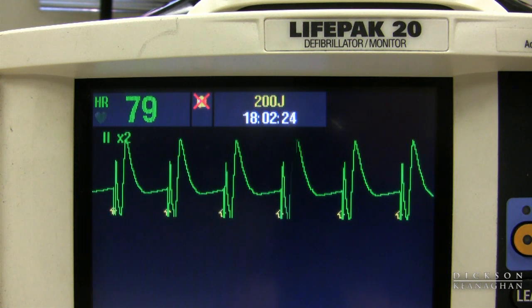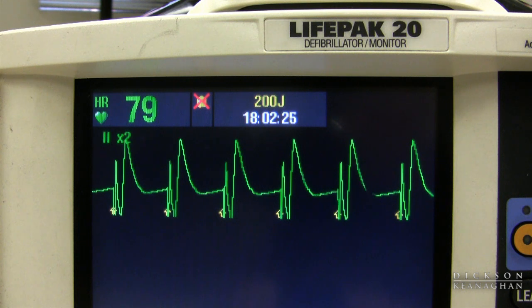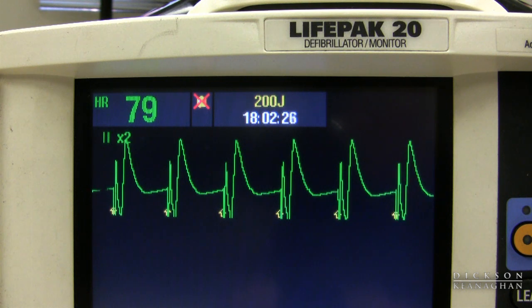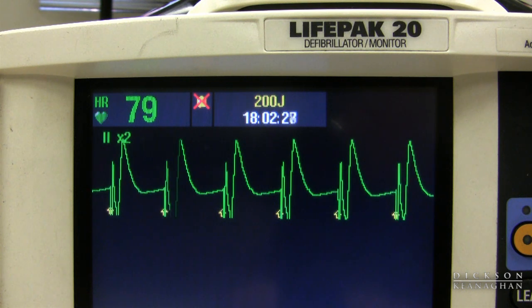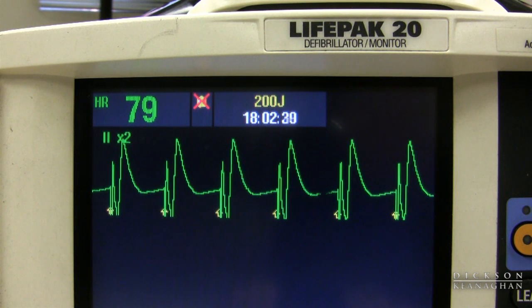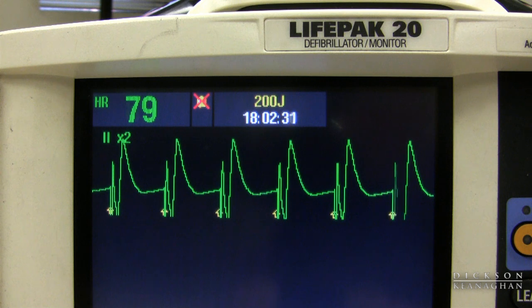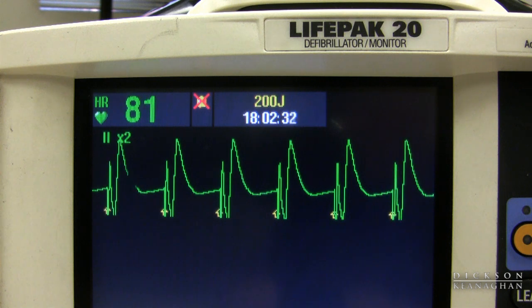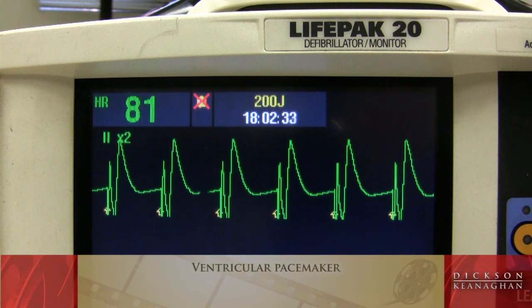I see a spike and an immediate capture. This is a paced rhythm — a ventricular pacemaker.